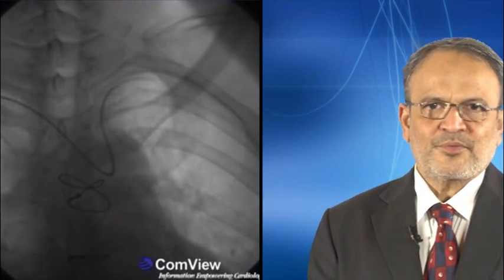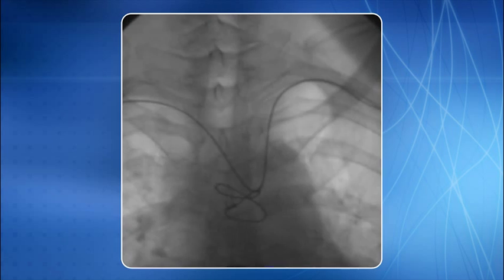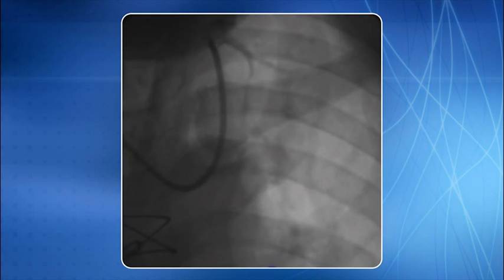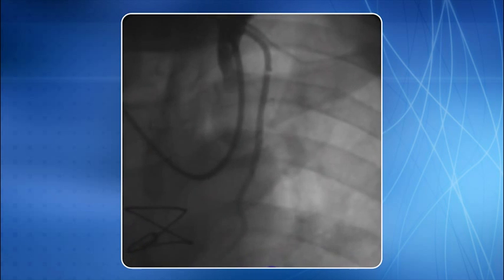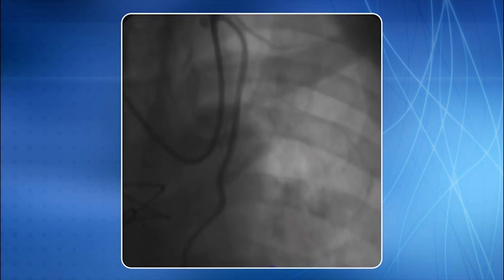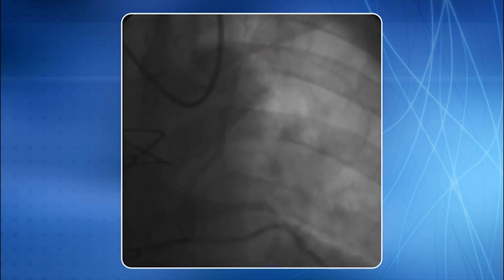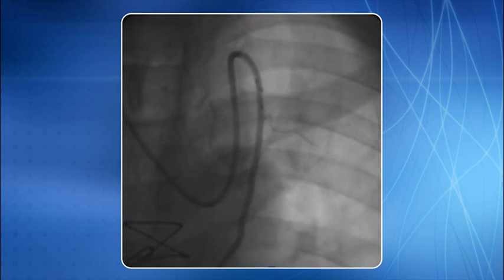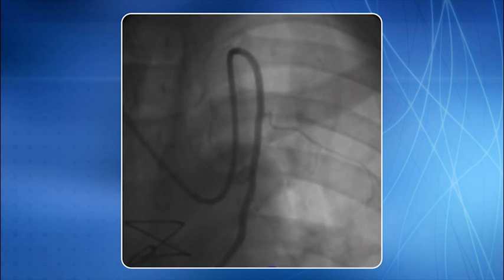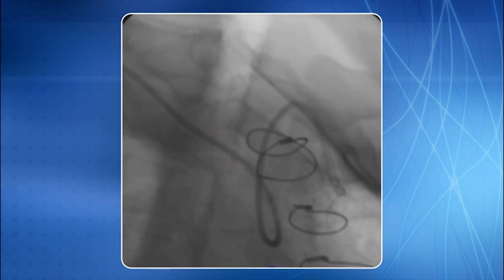Having shown the technique of diagnostic cannulation of LIMA using the right transradial approach, an example of LIMA intervention via the right transradial approach is now demonstrated. A 5F Simon 1 catheter was used to selectively cannulate the left subclavian artery. All steps from the diagnostic technique were repeated, and a 6F JR4 guide was cannulated in the LIMA. A membrane-like lesion was visible in the proximal part; a 0.014 inch BMW PTC wire was negotiated across it, and a stent was deployed. The end result was satisfactory.